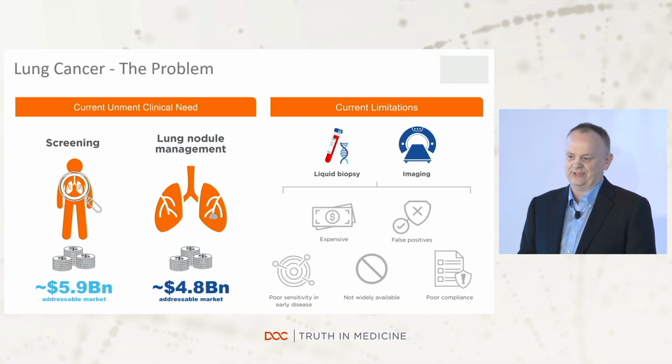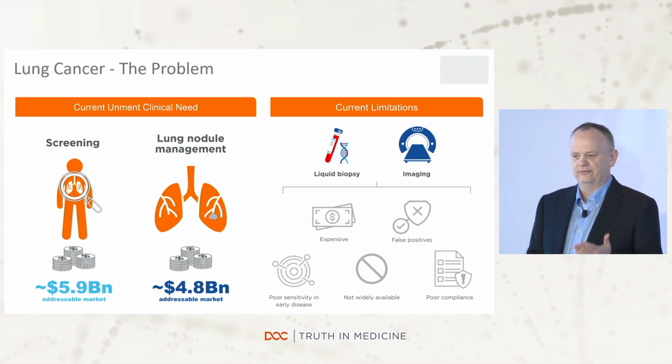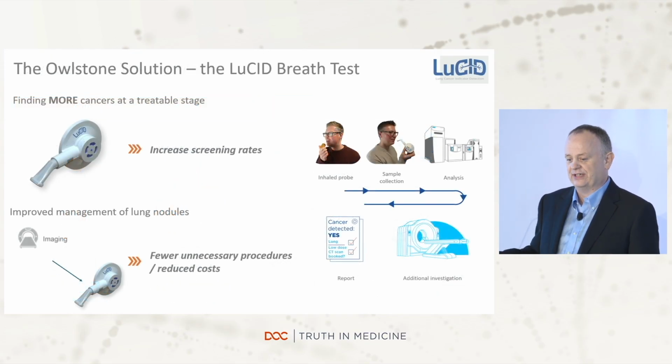Like low-dose CT is no copay, sort of free in the US, only 4% of people comply with it, and state to state, in some states, it's incredibly low. So people just don't want to do the test. So if we can bring a test to a patient, we can hopefully increase that compliance rate as long as we can get good enough sensitivity at early stage.